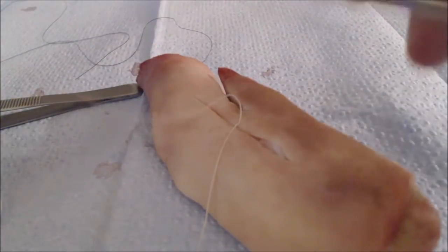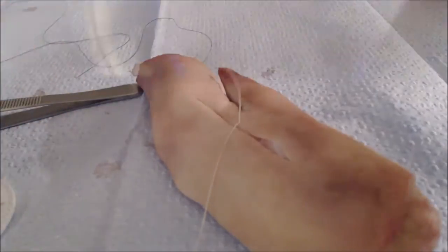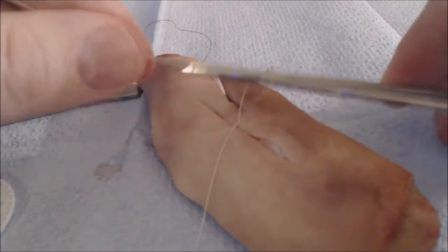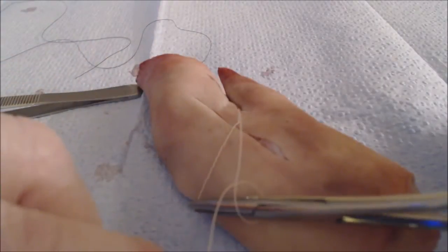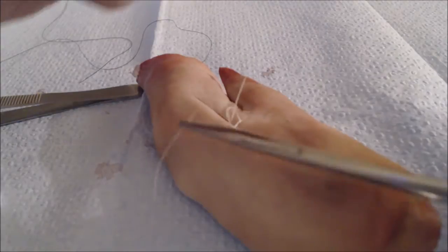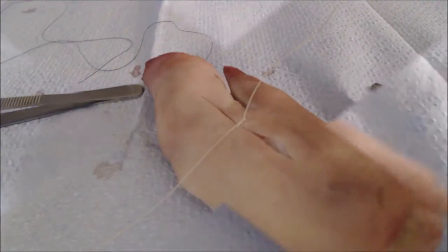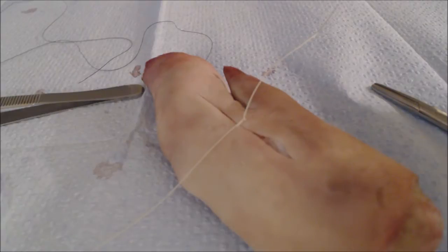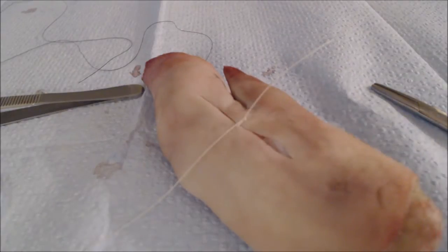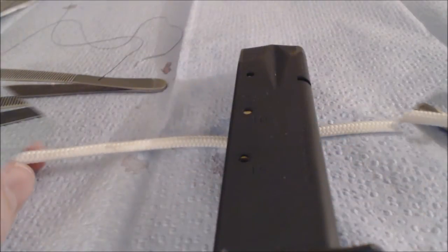Now, for our follow-up knot, we won't wrap it around in the same direction, but the opposite direction. This will help ensure that when we grasp the end of the suture material and pull it through, our knot will lay down into a flat square knot. These knots are very difficult to see lay down square with thin material, and that's why we use thick material like this to illustrate the principle.